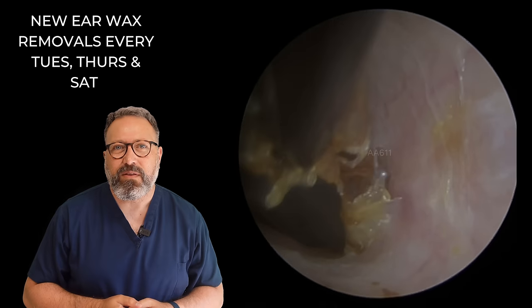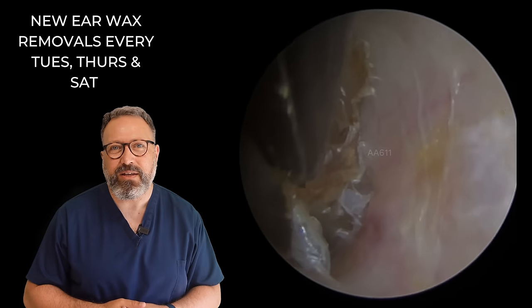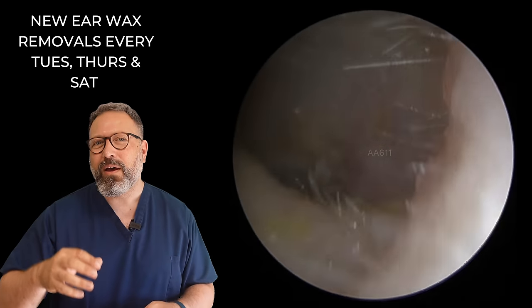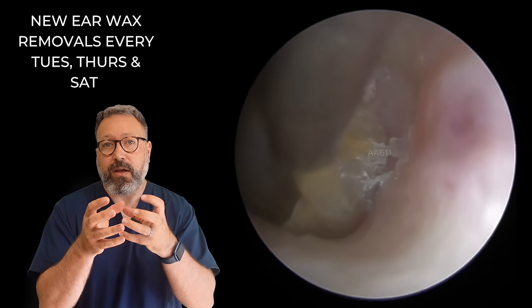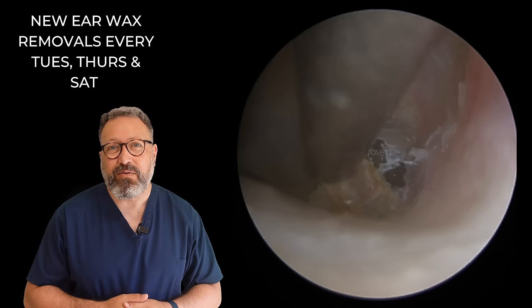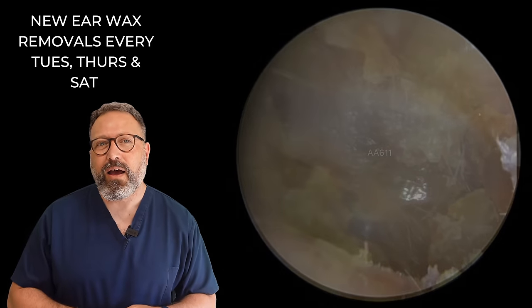Look at that peeling away — you can see how it just loosened up from that one side. So we're just going to get this last little section. I'm hoping this is going to come out in one piece. Just repositioning the forceps. It's taking that top section away really well, but now we've just got this bottom section that's just lifted up. So I'm going to switch back to the fine end and do the same thing again — bunch it all in together. You can see we're just kind of holding on. Look how it's trying to peel — really tough old stuff. Now it's starting to break away. We can bunch — there it goes. You can see that dead skin — there are a couple of little lifts, but they're going to stay quite solid.